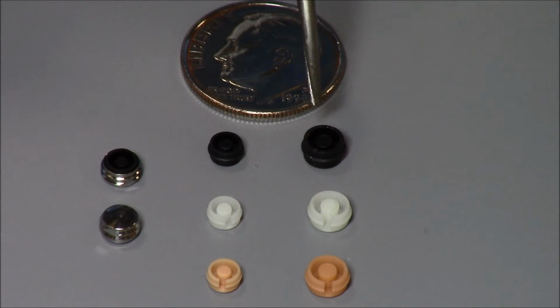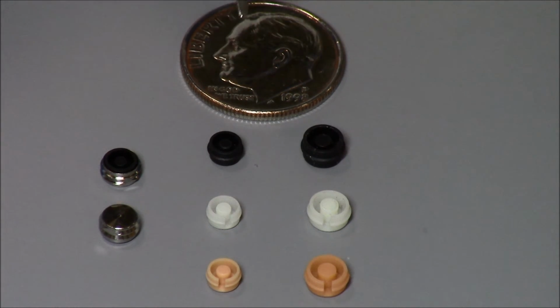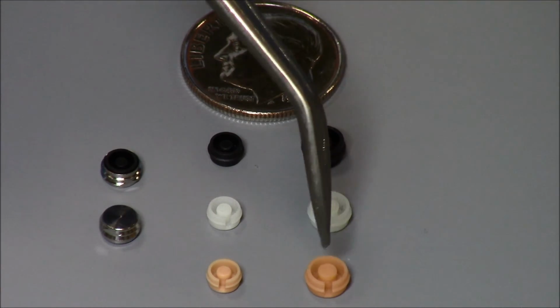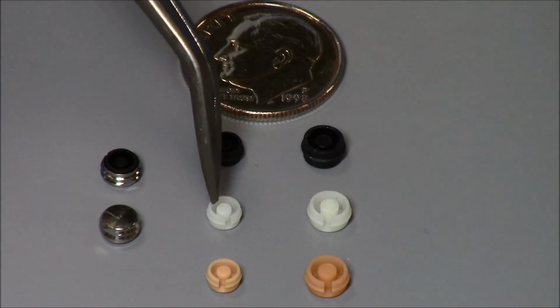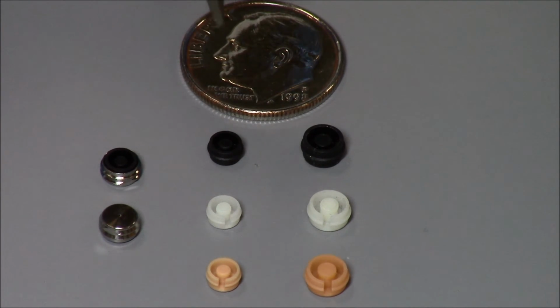You'll notice that the black males have no opening in the side wall, because when we process them in the denture, we don't want any acrylic or composite to get in against the female. However, there is a small slot in the side wall of all of the final males. This gives the nylon a little flexibility, so it's easier to snap in place.